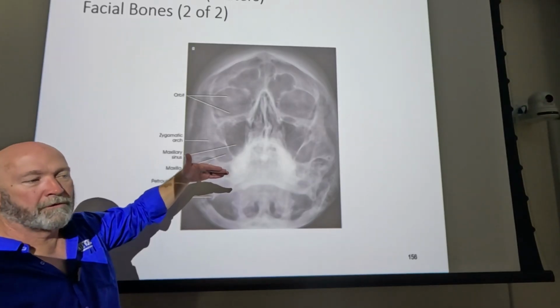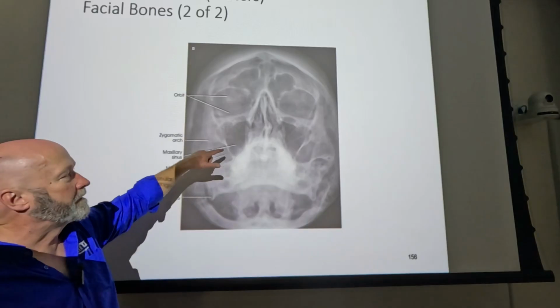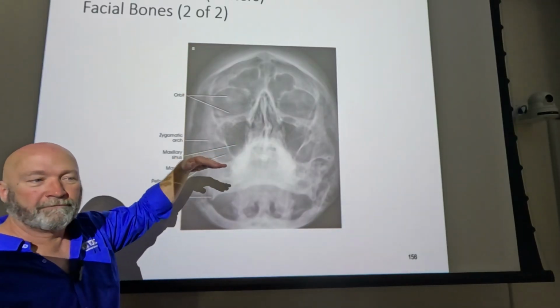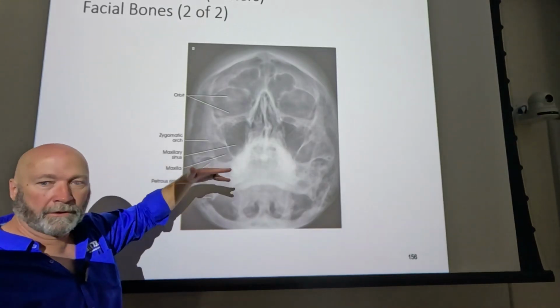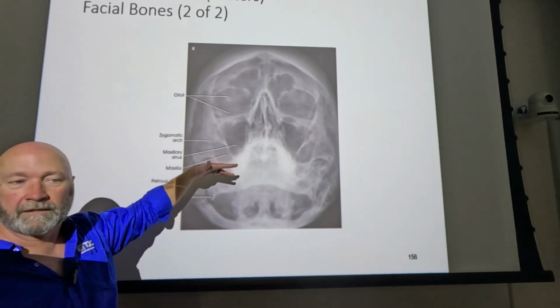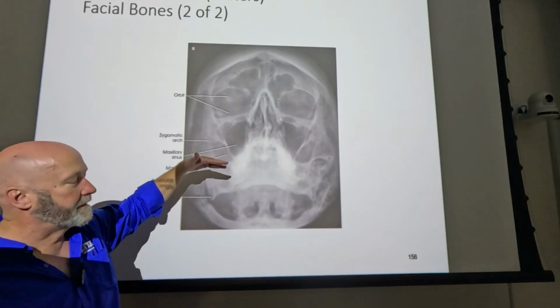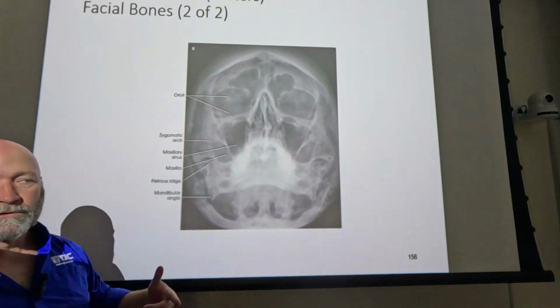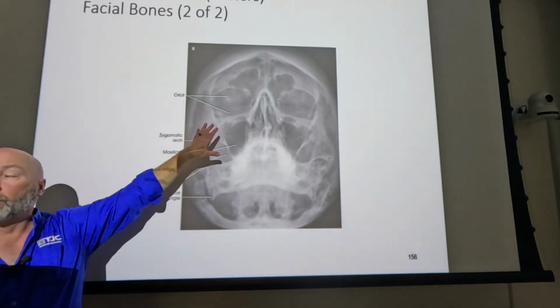It's going to be a hard fracture to diagnose anyway, but with 37 Waters, the only thing that we're going to see is evidence the patient has a blowout fracture. 55 Waters, on the other hand, takes the floor of the orbit and puts it perpendicular to the image receptor. 55 Waters, see the blowout fracture? Maybe. 37 Waters, evidence the patient has a blowout fracture. Okay? So on your facial series, especially if they're concerned with blowout fracture, you may do both Waters.